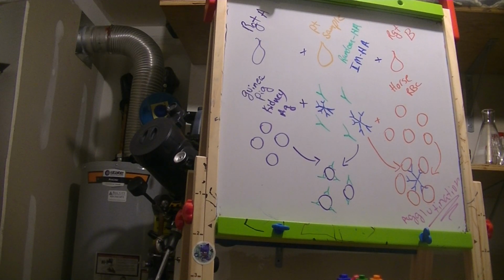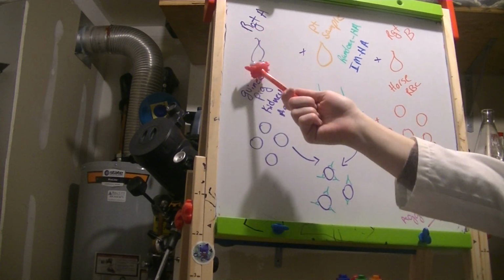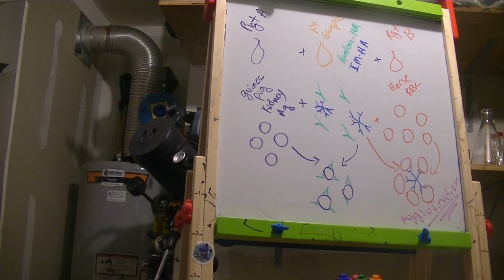Okay, so the explanation of what is happening in the color slide 2 mononucleosis agglutination test: we had reagent A. Reagent A, we used 1 drop, and in reagent A are antigens from the cells of guinea pig kidneys. I misspoke in my procedure video, I believe, and said antibody. I apologize for that. But reagent A contains antigens from kidney cells of a guinea pig.